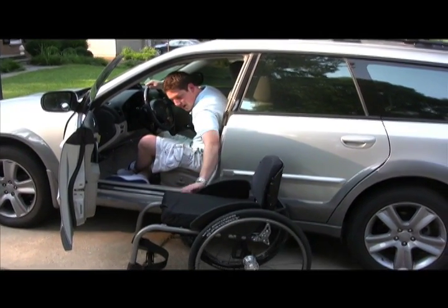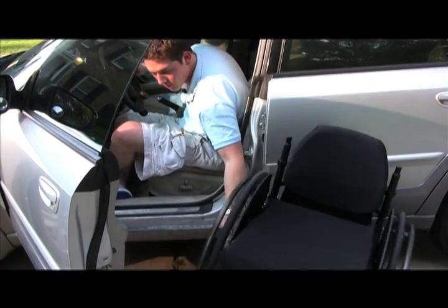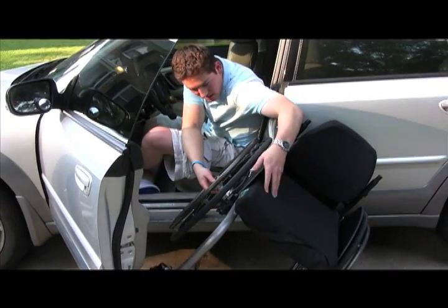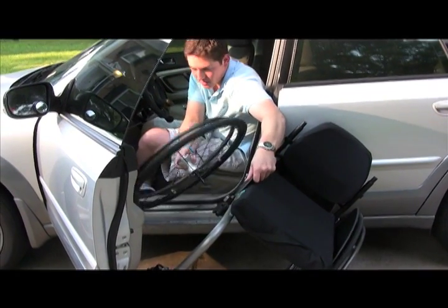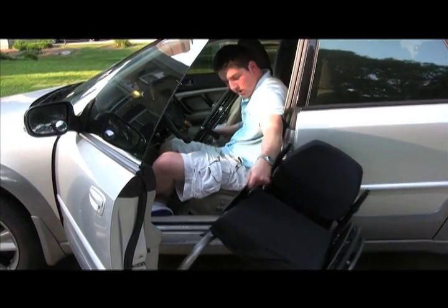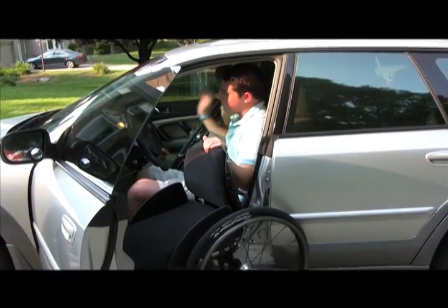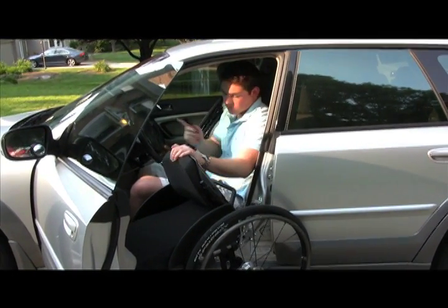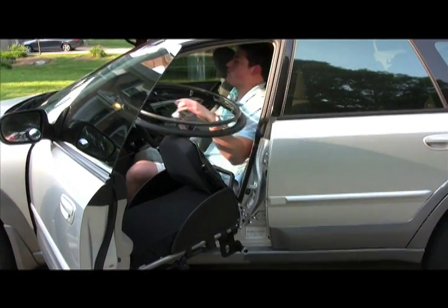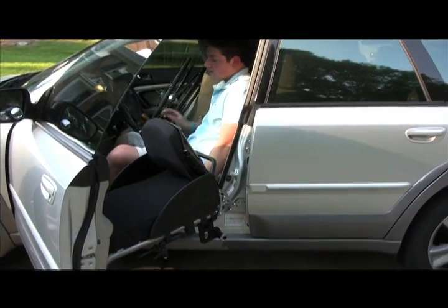Okay, now to get my chair into the car, I start with the inside wheel, the wheel closest to me. I just pick it up by the hub, basically scoot the whole chair over like that, hold the chair by the side guard, whatever you got, your cushion, anything like that. Take the first wheel off, maneuver it through the car, and put it right there in the empty passenger seat. It really helps to have your passenger seat as far forward as you can ahead of time because it makes it easier to get the wheels in and also to get your chair into the back seat. I then take the second wheel off, place it in the front seat just like the first one, and now I'm going to lean my chair back.